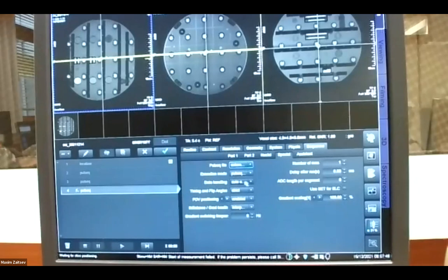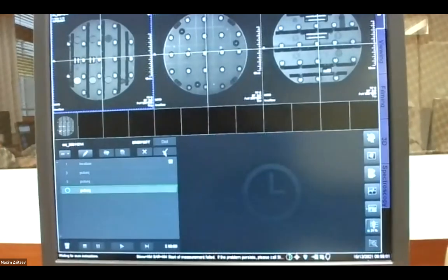And then you can run the sequence and the data will be automatically exported back to MATLAB. I would say at this point we don't need many more options. We just run the sequence. Could you hear it was running?